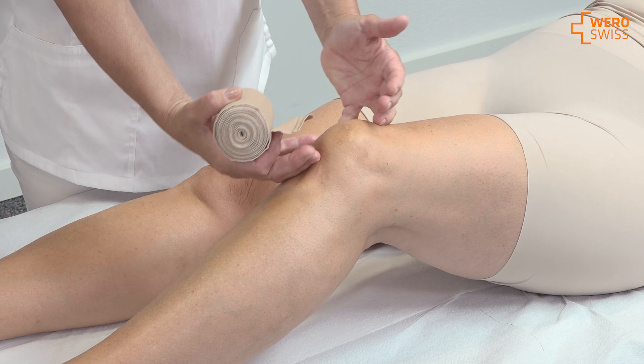I ask the patient if there is any discomfort. I check that the circulation is okay — no tingling, no numbing, no discomfort — and then I can leave it. It releases the pain and it stabilizes the knee.